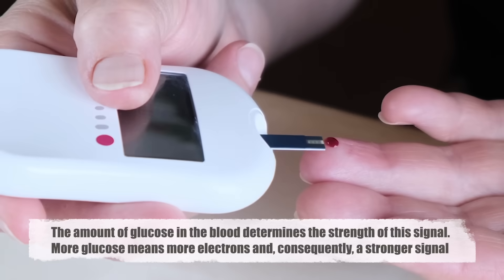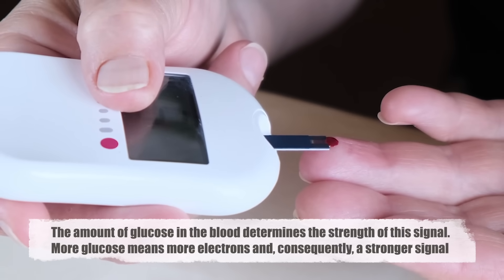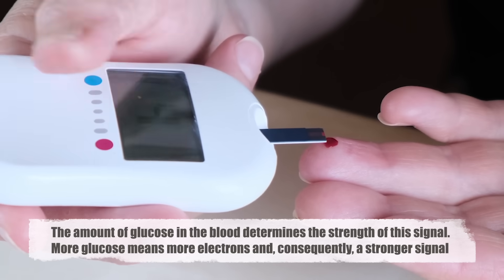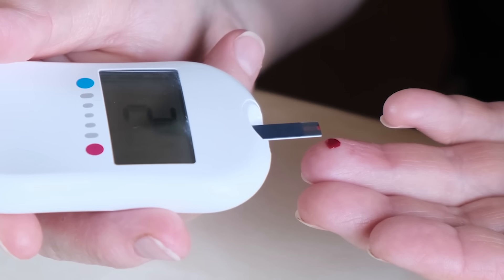The amount of glucose in the blood determines the strength of this signal. More glucose means more electrons and, consequently, a stronger signal. This signal then travels into the meter, ready to be interpreted.